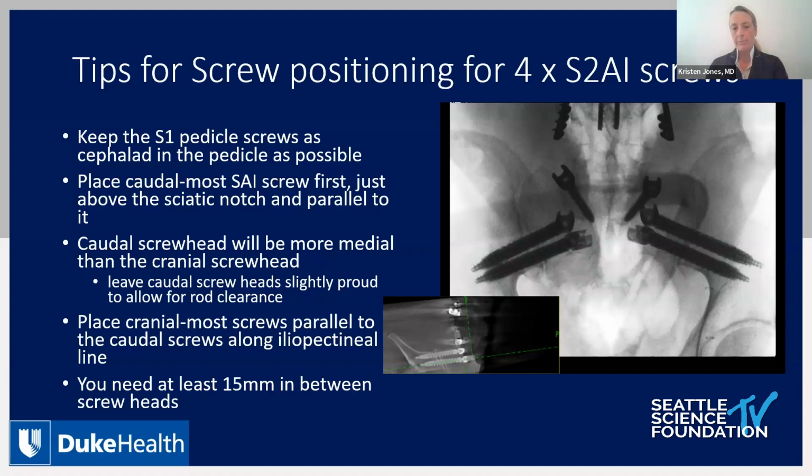And I'll basically aim right to engage the bone right above the sciatic notch with that screw, and then I'll place the more cranial of the S2AI trajectories, and that will basically parallel the other and will be right around the iliopectineal line.